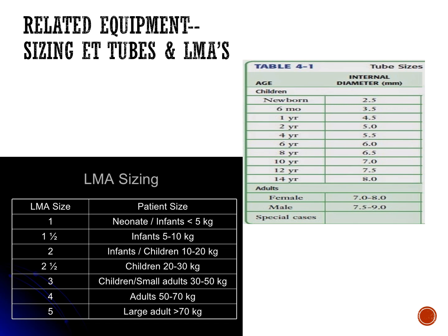LMA sizing is something that's not quite as well understood, but many intubation boxes will have LMAs, and I would say that essentially all of the difficult airway bags or boxes should have them as well. On the bottom portion there, you'll see 3s, 4s, and 5s. The children and small adults would be a 3, mid-sized adults a 4, and then a large adult greater than 70 or 75 kgs would be a 5.